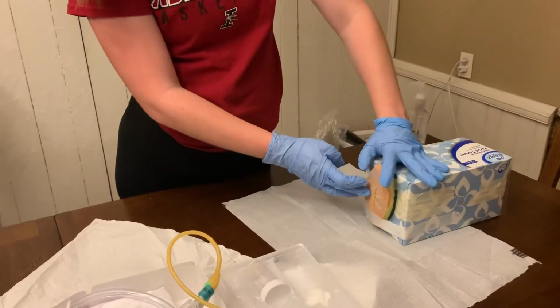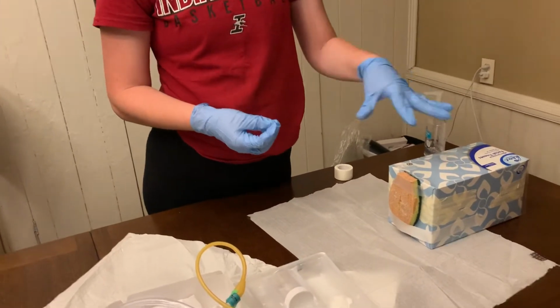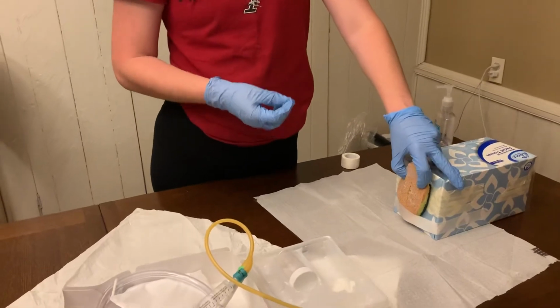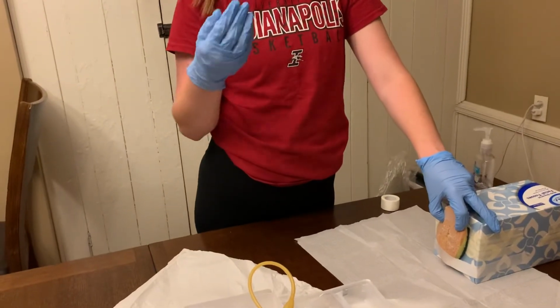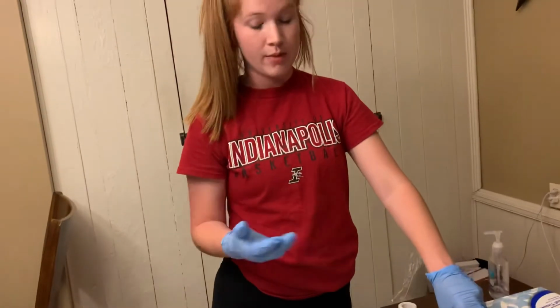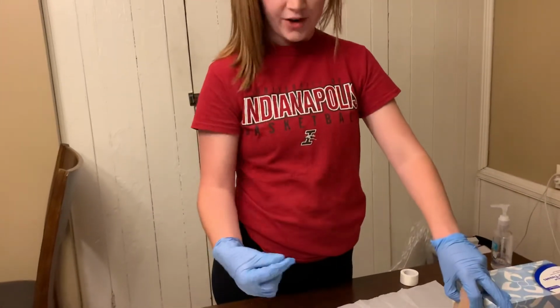Okay, so obviously, I would have to keep that in place, and these touch, so it would no longer be sterile. But I know that I have to keep my non-dominant hand in the same position to keep from contaminating. And this hand theoretically is contaminated, but for the purposes of the video, I'm going to keep going. I'm going to start that over. Pretend that everything is still sterile.